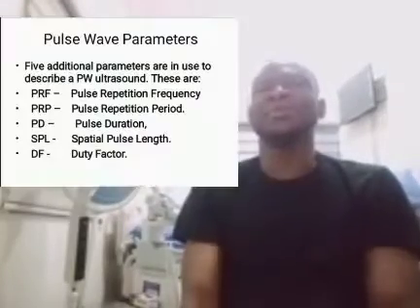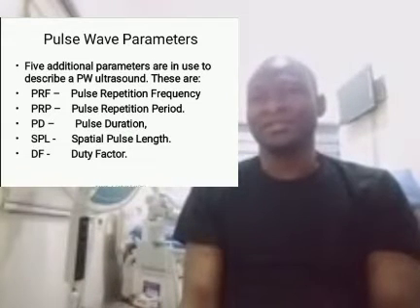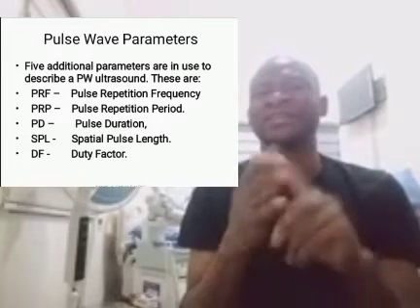So in pulse wave ultrasound, a pulse must have a beginning and have an end, otherwise it will be continuous. So that's why I try to depict it as the cars of a train. There needs to be a starting point and an ending point. So there are 5 additional parameters which we'll look at to describe pulse wave ultrasound, which will be the PRF, the PRP, the PD, SPL, and DF.